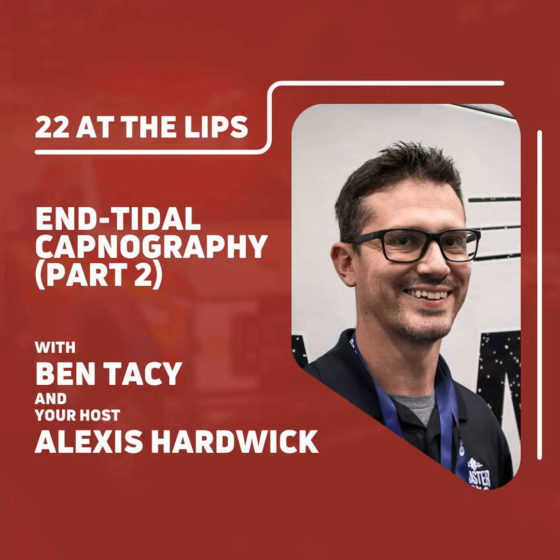The only big things that I have are what helped establish end-tidal carbon dioxide measurements. Carbon dioxide, kind of like you said, the exhaust pipe, is just the product of metabolism that's transported via perfusion and expelled through ventilation. I know that's a mouthful, but that's what helped me establish the understanding of it.